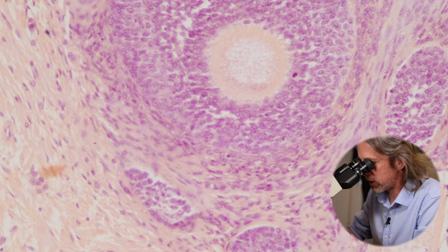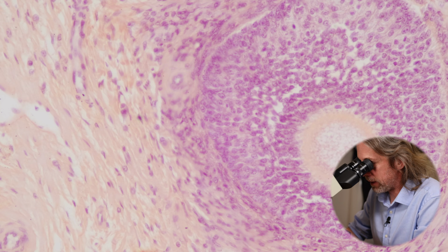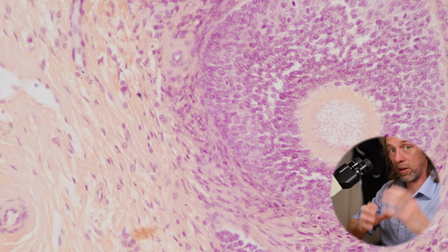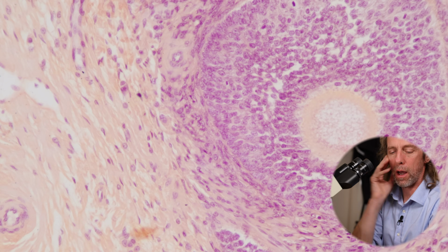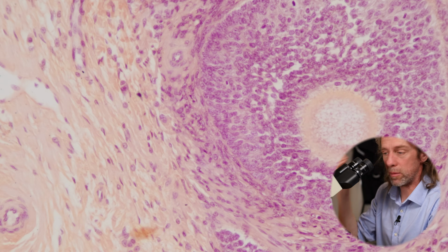How well can we see the theca interna and the theca externa layers? Well, the theca externa layer is going to be a connective tissue support. The theca interna is going to produce androgens that the granulosa cells will use to make estrogen.